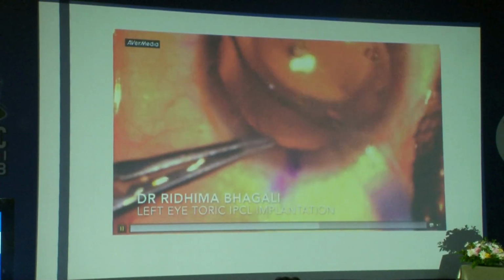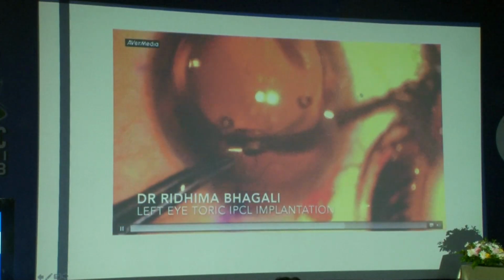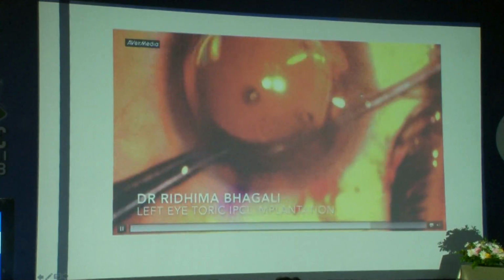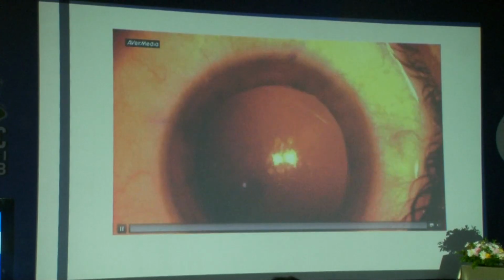This is the left eye. So you can see that the edge holes are superiorly. So when you load, they have to be oriented on the right side for the left eye. And then tucking it in and removal of the viscoelastic.